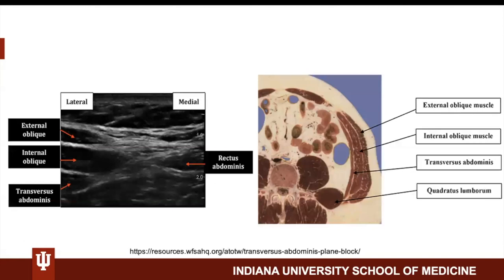Here we see the three muscle layers including the external oblique, the internal oblique, and transversus abdominis. Here you also see the rectus abdominis, and I want to note that the lateral cutaneous nerves run along this region.